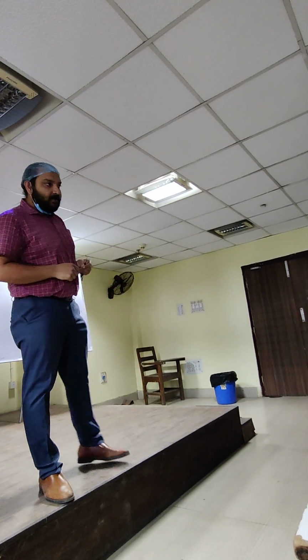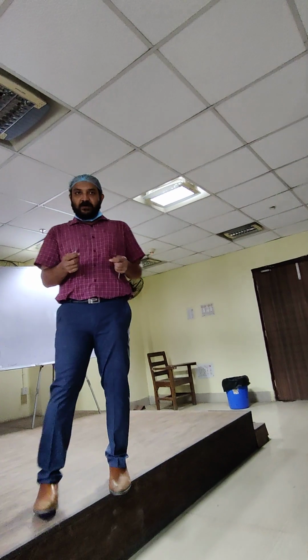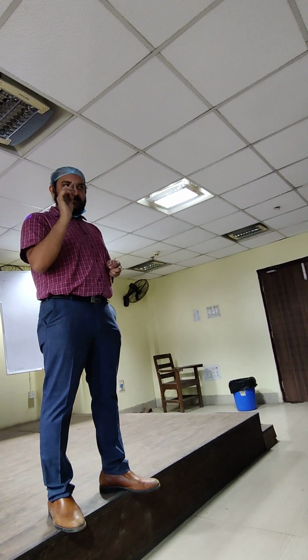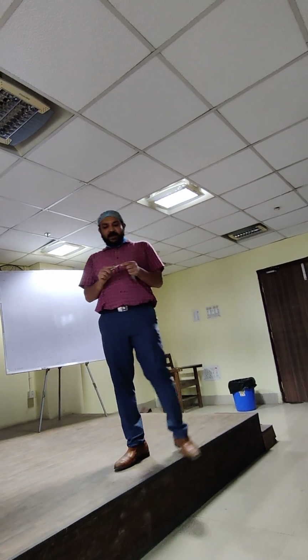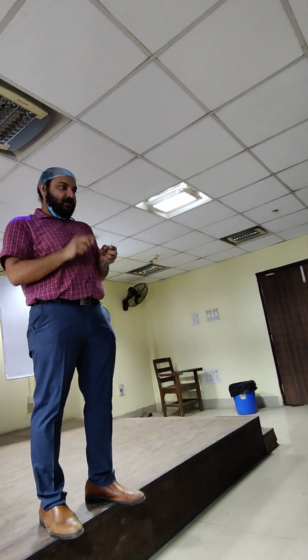আর স্যার ওটা একটু বলে দিন কখন মিজিয়াল আর কখন ডিস্টাল? ওটা বেসিক্যালি যেটা, if you are taking out upper eight, so we'll always have to remember two things. One, the concavity should face the tooth that we are removing, and we are using the elevator in the mesial side always, most of the time, because distally there is no tooth. The mesial side and the sharp end. So instead of that, you can remember the pointed end should always go mesial.